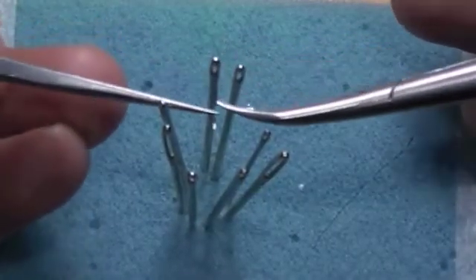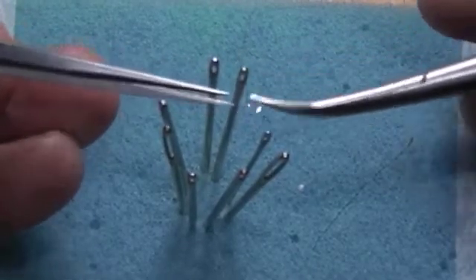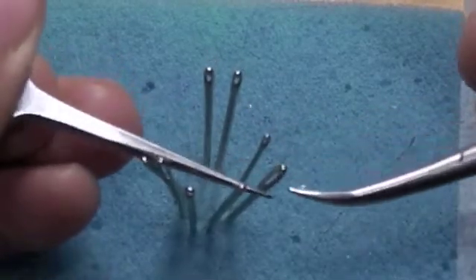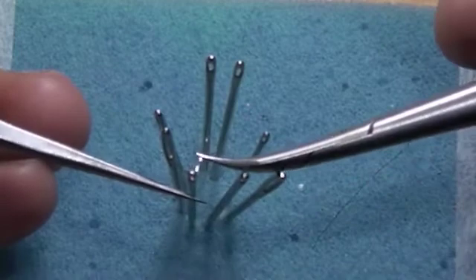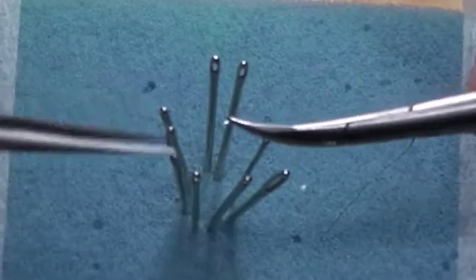Start your task from the 12 o'clock position. As you pass the microneedle through, don't grab the tip of the microneedle as it damages it. As you pass it through each sewing needle, when you catch it to the other end, place your forceps and your needle holder in a position so you're prepared for the next pass.